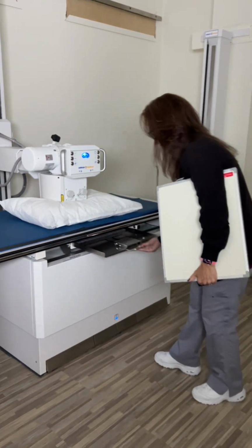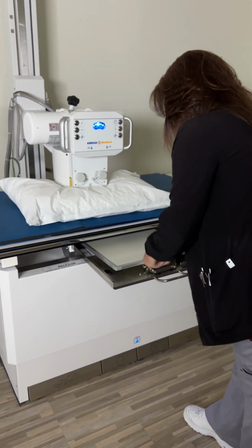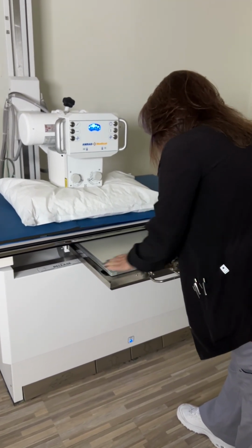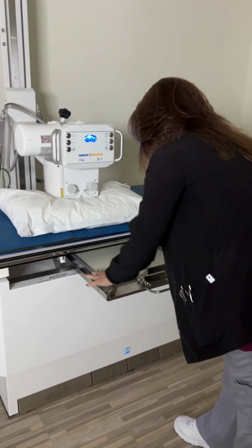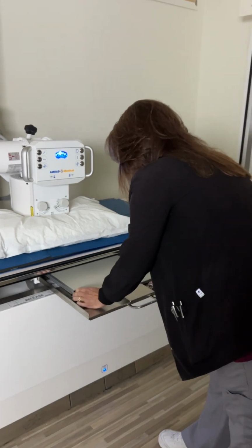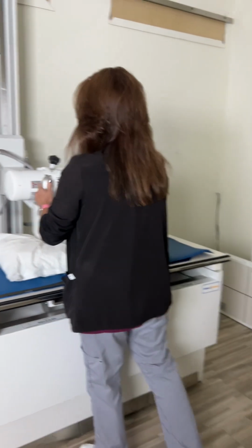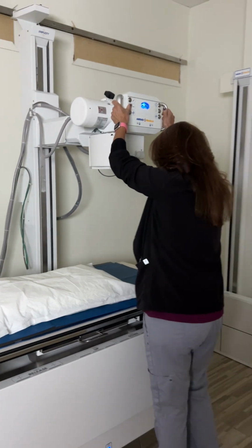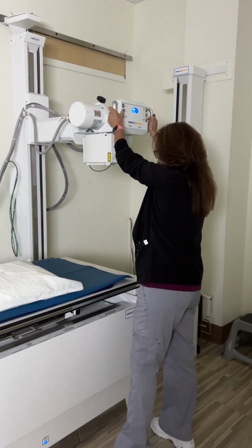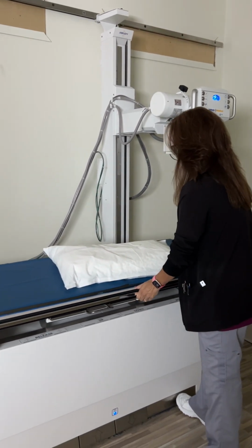So I've got my image receptor. I'm gonna bring that in and place it crosswise to my patient, and lock that into place. And then I'm gonna move this out of the way, because anytime you put a patient on the table, you wanna make sure that your tube is not in the way for them at all, because patients don't always pay attention and you don't want them to knock themselves out.